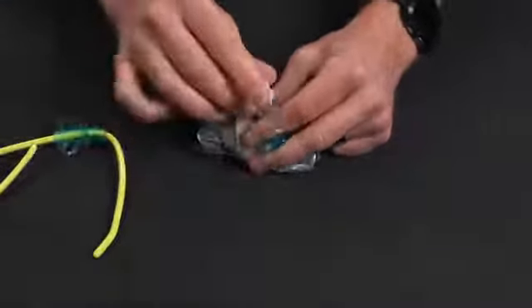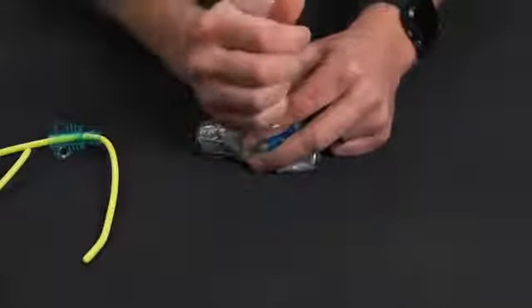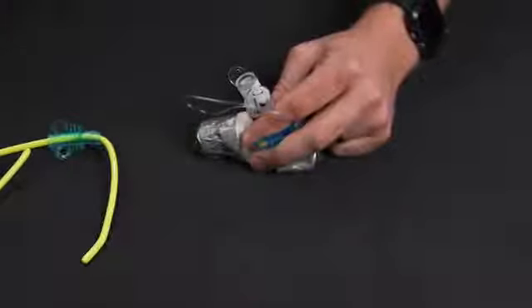Once we have that, we confirm it the exact same way we would an endotracheal tube. We want to put capnography on that. We're going to take a bag valve mask, start ventilating the patient, and we're going to listen to lung sounds, and we're going to listen for the absence of epigastric sounds.